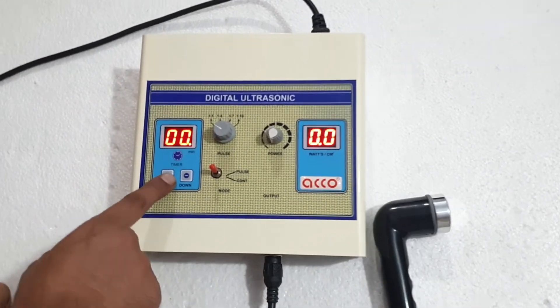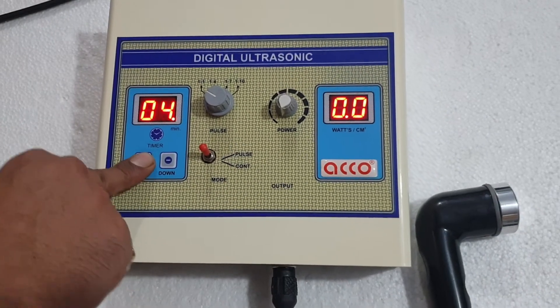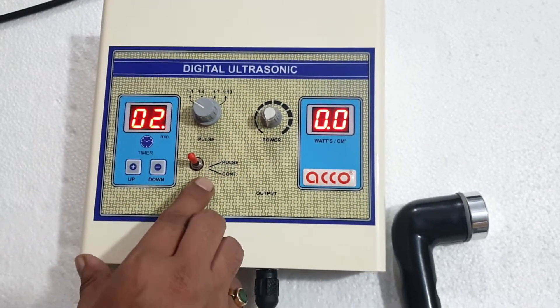This is the timer knob — you can adjust timer up or timer down. It has two modes: pulse and continuous.